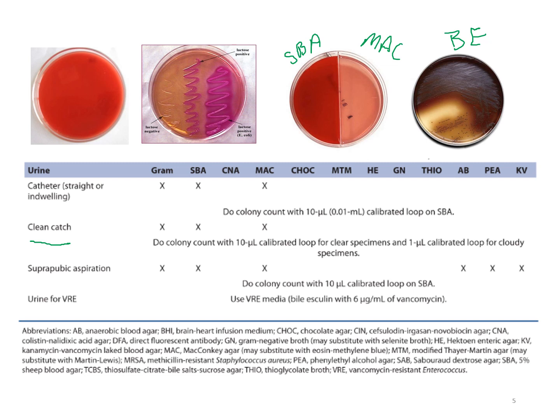We're going to talk about an organism called vancomycin resistant enterococcus, and this is what I was referring to as far as that bile esculin plate. There's a special plate that they will use to help work that up, or that test may actually be done through automation. So that can vary from lab to lab.